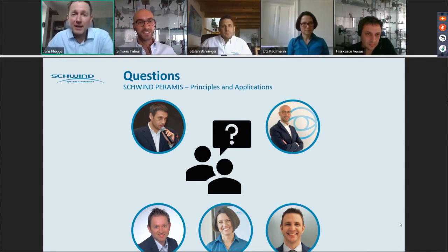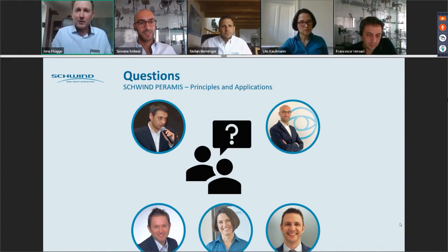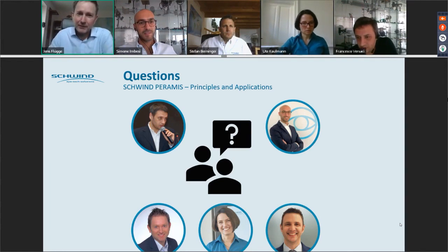In case the eyelid is in the way, the SCC is probably not functioning very well. What I always do in the introduction phase is, before you click the measurement, you blink, you open both eyes wide, and then you capture the image. That usually should already do a good job for capturing the SCC.